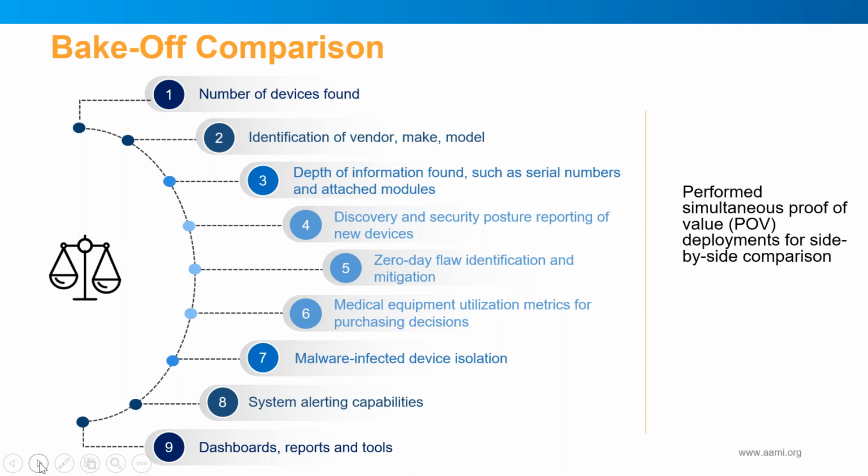When we saw the inventory discrepancies, we looked for the things that stood out to us the most, the most obvious variances in inventory quantity. We dug into the details to figure out why each system would see or not see that specific device. That was very important to us. We want reliability and consistency in how the system detects our inventory.